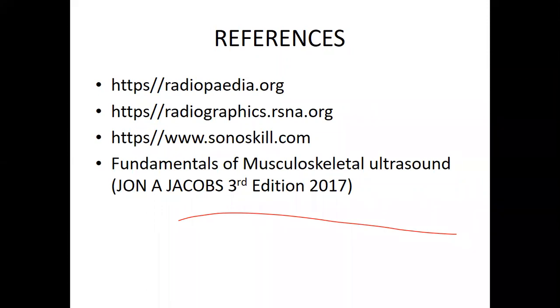Just to quickly respond to your question on the acromioclavicular joint, I also found it a challenge. I went into my literature review. I tried to look at the nomograms. I could not find any. What was really coming out is that with experience, you have to compare the contralateral side. I never came up with the normal, unless there's anyone with the nomograms, I would love to hear from them. But I really checked the literature review.